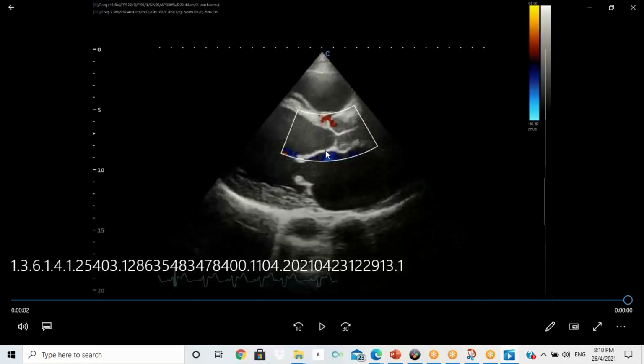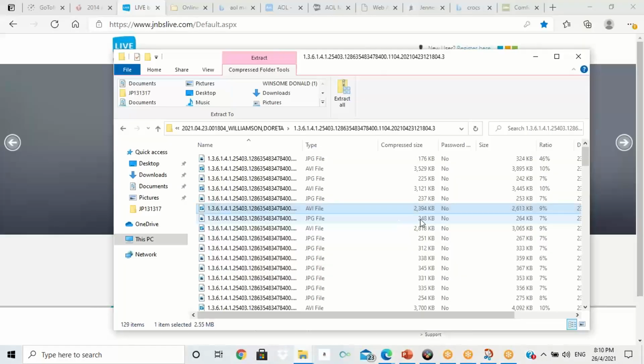So, you have to do multiple manipulation to see what's going on. One little view is not going to help you too much.